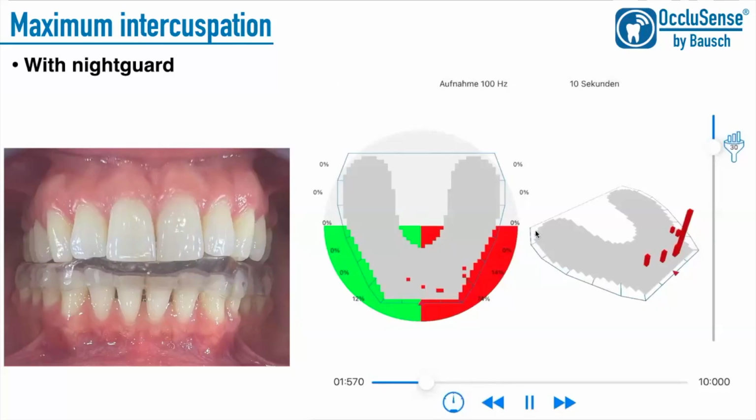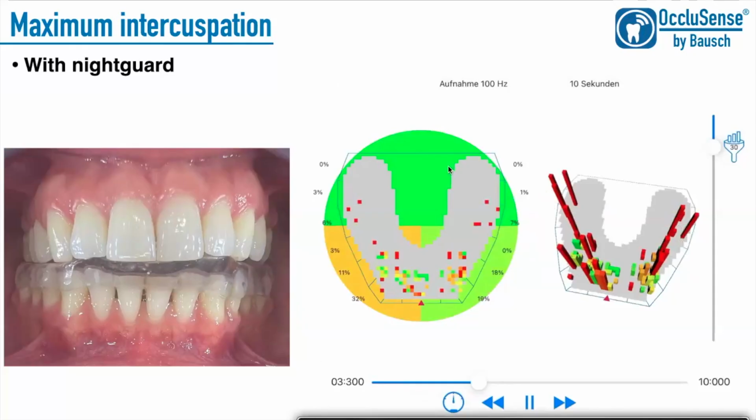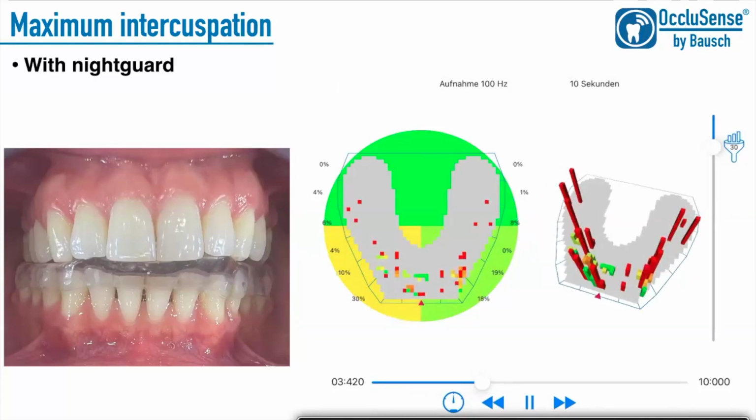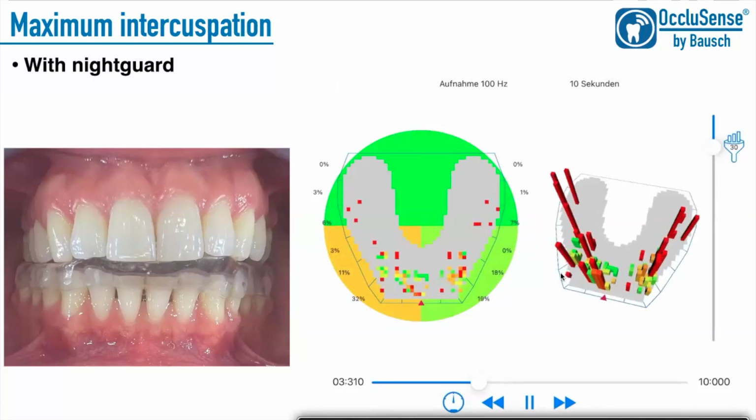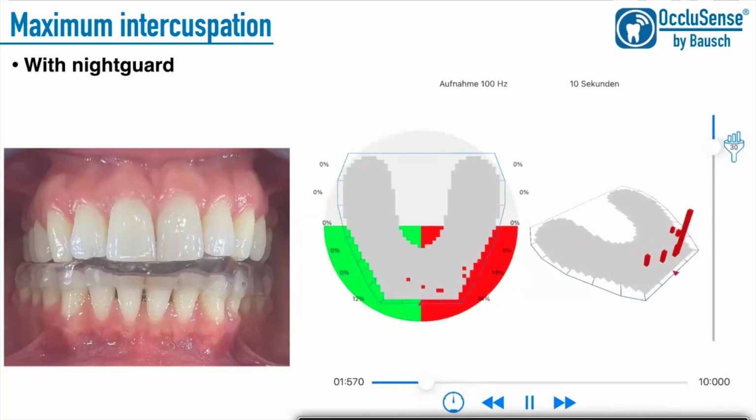And when you are doing this, and let's imagine we're doing this in this case, the only thing that we see, if you remember the analogy that I showed you earlier, we receive only a picture, so a snapshot in time, right at the end of the static, I call it movement. So if we here look at our foil being pulled out everywhere within the dental arch, we should receive roughly the same resistance. What we are missing, however, when we are doing this shim stock protocol, is everything that's happening before that.